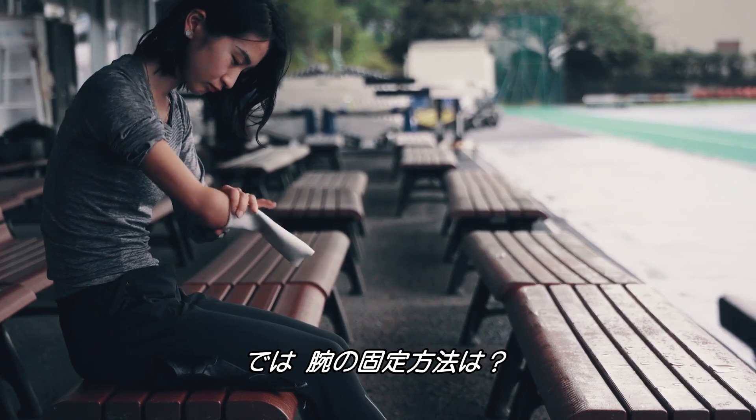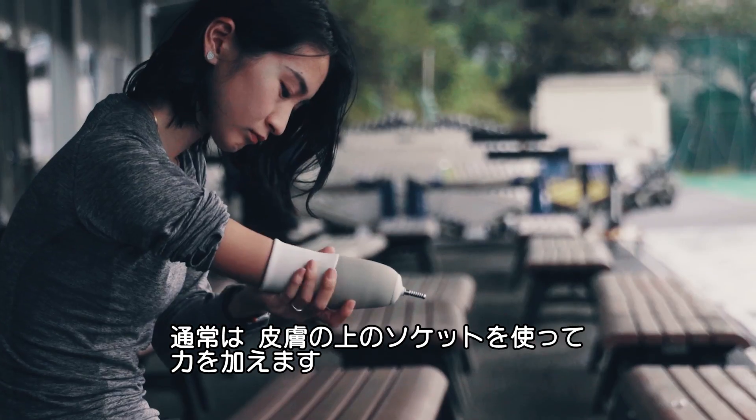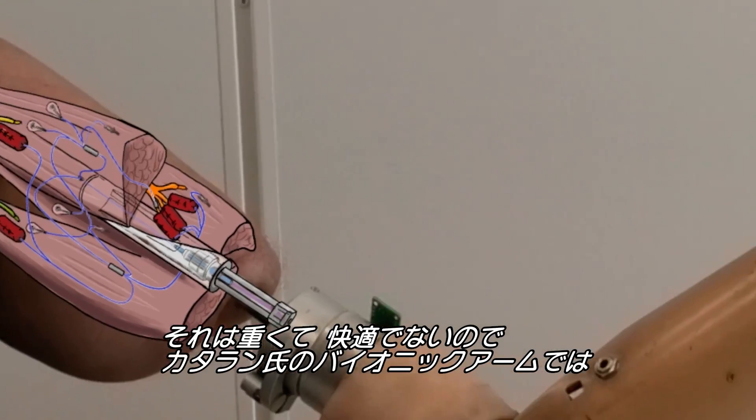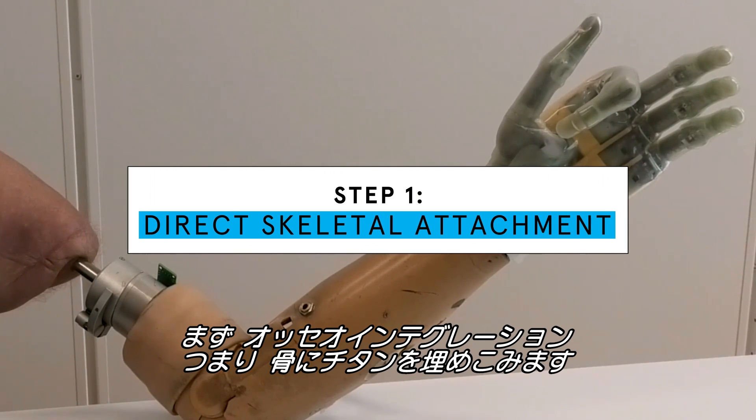But how do you keep the arm in place? This is normally done with a socket — something on your skin that puts a lot of pressure. It's uncomfortable and heavy. So the first step in installing Dr. Ortiz Catalan's bionic arm is osseointegration: implanting a titanium structure directly to the skeleton.